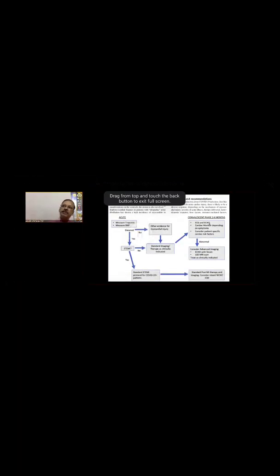If you don't have the facility of doing strain imaging, then cardiac monitoring depending on the symptoms, then consider patient-specific cardiac risk factors. The other risk factors like diabetes, dyslipidemia, obesity have to be corrected. If any of these abnormal things is there, or the patient is symptomatic, or if you want to be sure, at least do echo with strain. If not, LGE with the MRI scan.